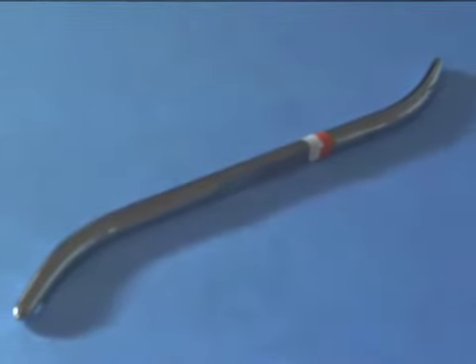Most surgeons use a technique called blunt dissection. It involves making a pocket for the breast implants by tearing the breast tissues with a gloved finger or a blunt instrument. It's very fast, but it's also very dramatic for your tissues.